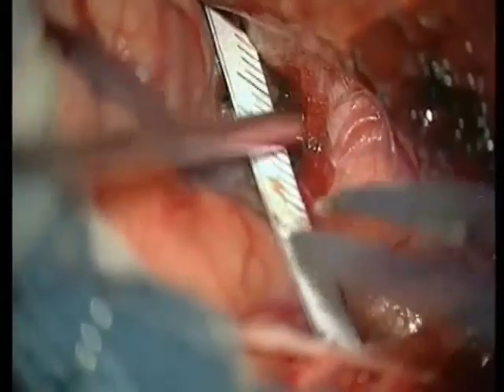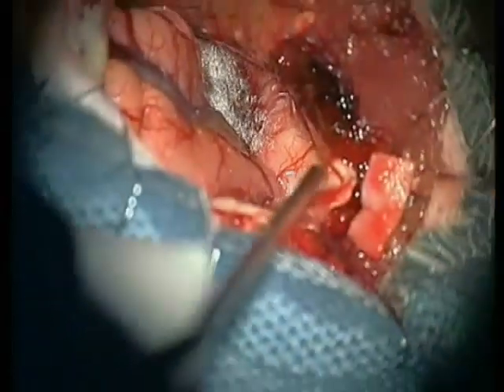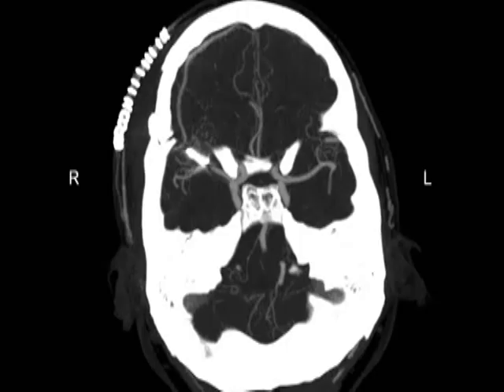The opening of the sylvian fissure was less than 20 mm. On the postoperative CTA we see patent M1 and the cortical branch.